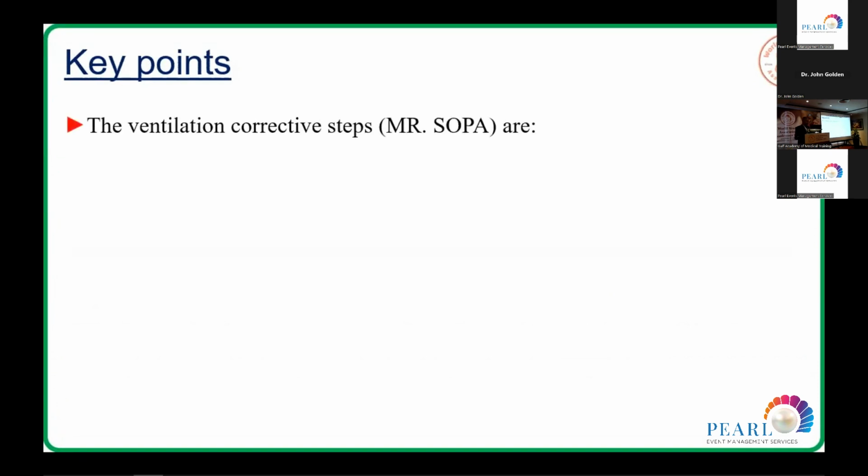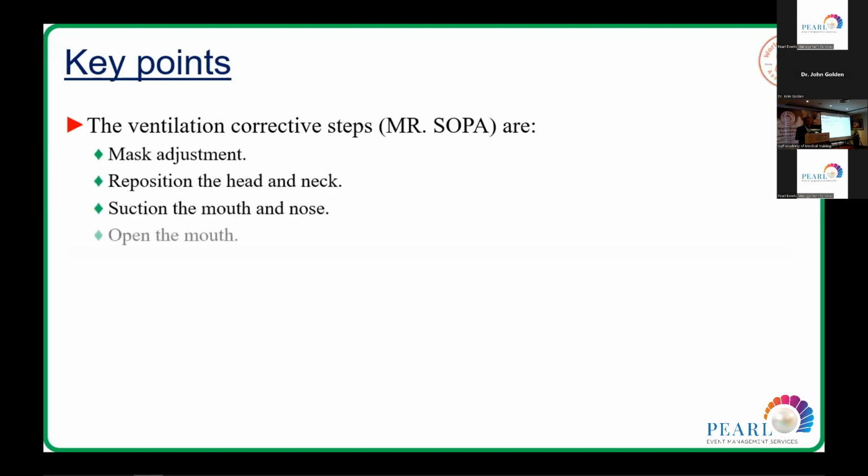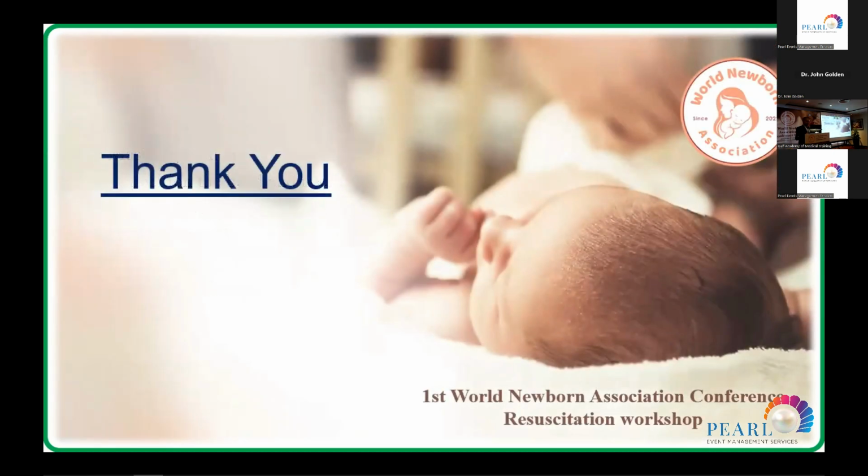The ventilation corrective steps are: mask adjustment, reposition the head and neck, suction of the mouth, open the mouth, pressure increase, alternative airway. Thank you very much.